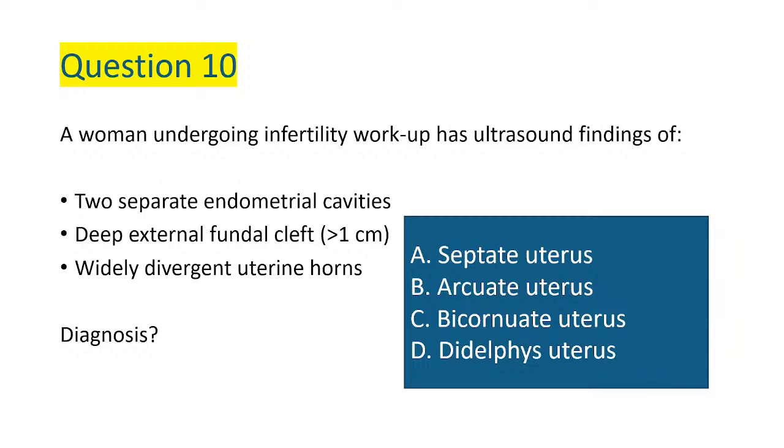With a bicornuate uterus. Ladies and gentlemen, this marks the end of our expert quiz daily challenge, answer and explanation discussion. I hope you're doing very well.